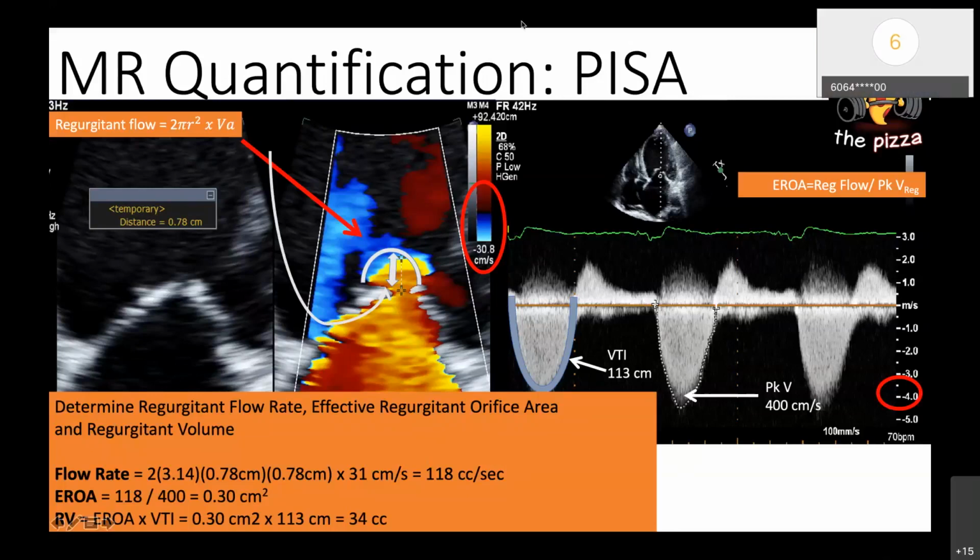Yes. Okay, perfect. So the regurgitant volume, that's where you use that VTI calculation. And while we have this beautiful continuous wave Doppler up, I really like this view as well, because this also gives you another set of information. Desiree alluded to it when she said this is how you should tell how dense the jet is. And it also gives you the timing of the MR.